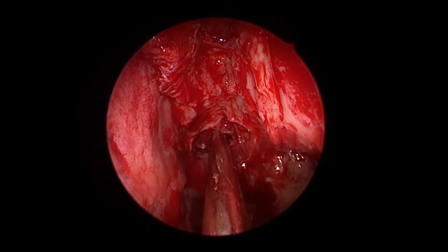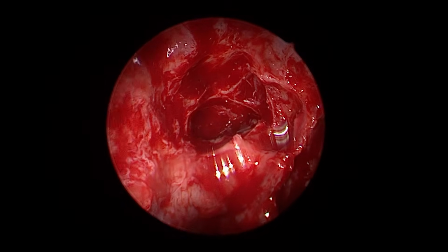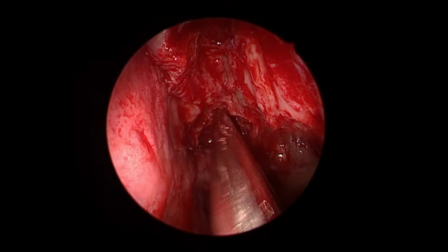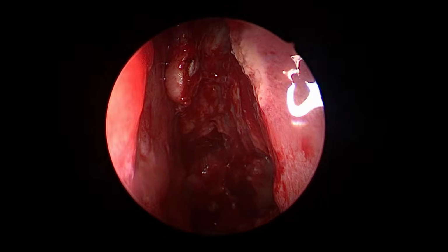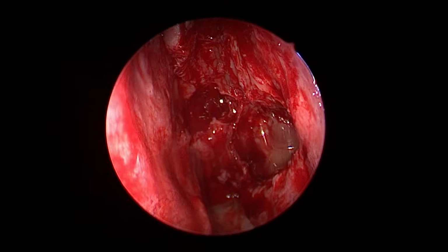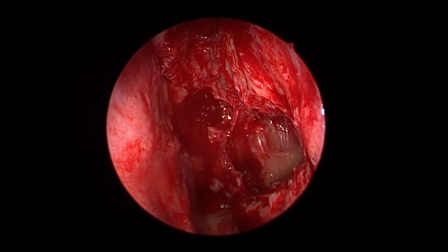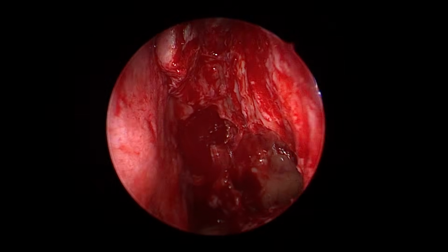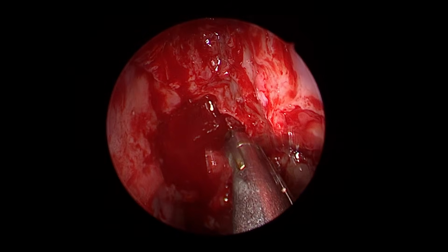So I am widening finally the sphenoid. Be careful while widening the inferior wall. You may damage the septal branch, which may bleed later on. See now, this kind of access cannot change. Once this is done, after the entire bone work is done, you can tell your patient that in future you don't need a formal sinus surgery, provided you keep irrigating well.